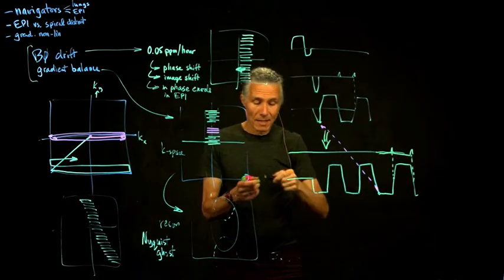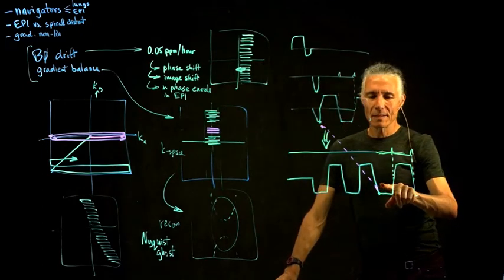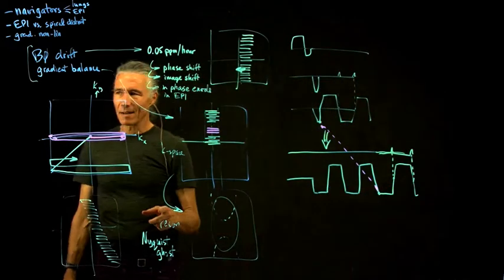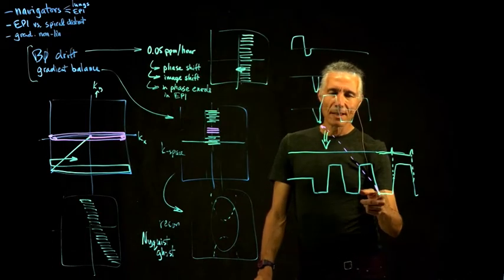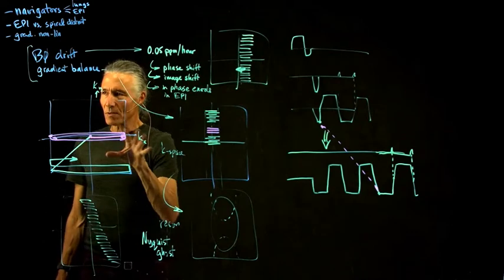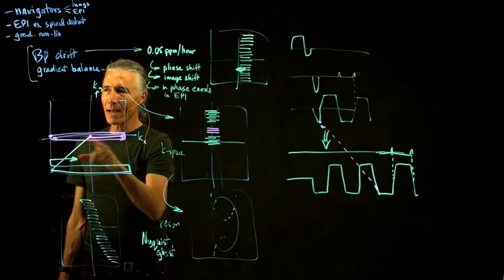Usually there's a little bit of a delay because we have to process that data very quickly. We only have 1 millisecond to process that data and figure things out. I just jumped ahead. What will you get out of this? What you'll get out of this is 3 big echoes.